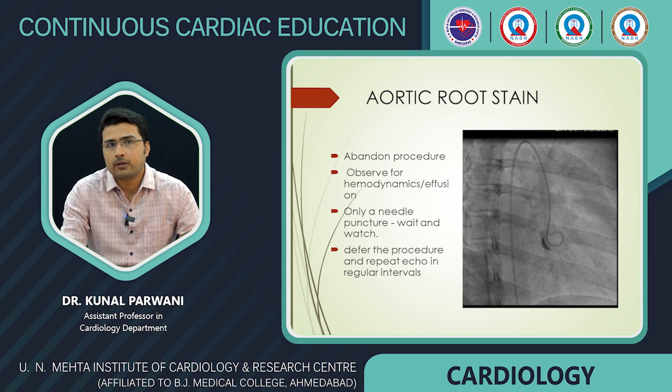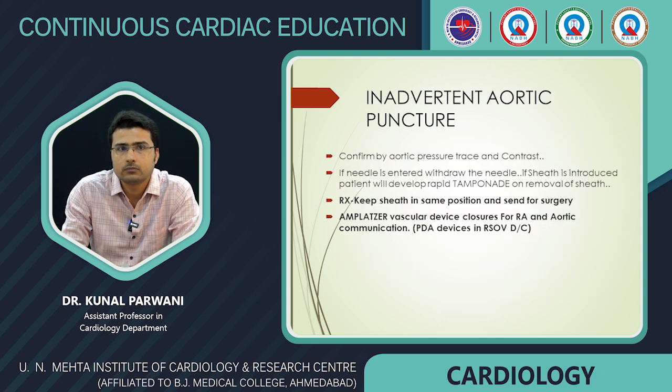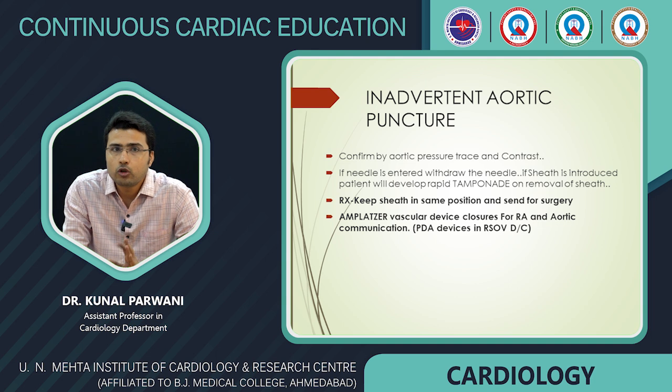Aortic root staining. If this happens, then we have to abandon the procedure and observe for hemodynamics and effusion. If only a needle puncture is made, then wait and watch and defer the procedure. Sometimes inadvertent aortic puncture is made. Confirm this by the aortic pressure trace and contrast. If the needle has entered, withdraw the needle.